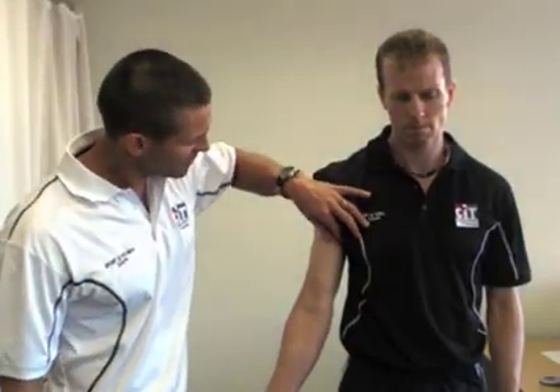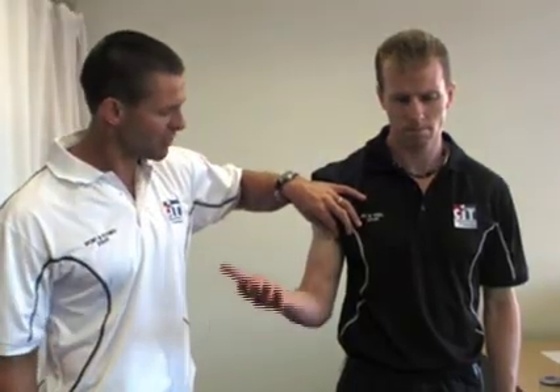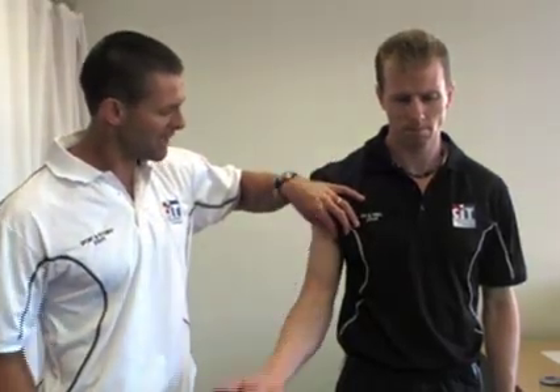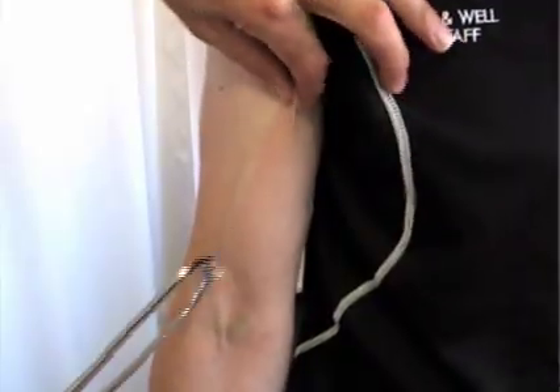It's fairly easy to differentiate between grabbing skin with the layer of fat underneath and grabbing muscle. If you grab muscle you're going to cause a lot of pain. If you're concerned, you can grab the skin and have the client do a basic bicep curl — if you actually grabbed muscle, the skin would have pulled away.